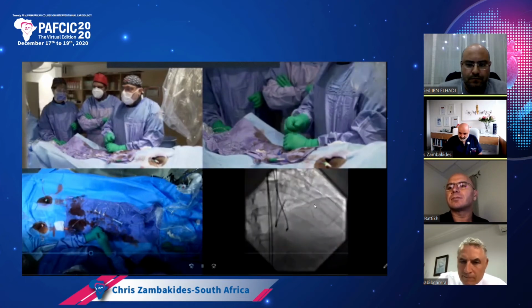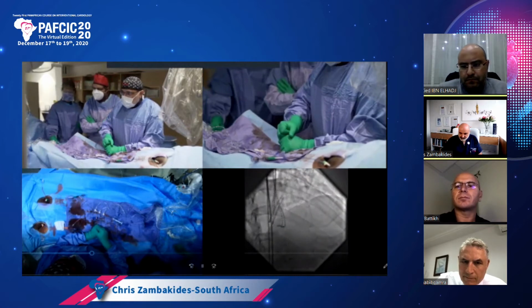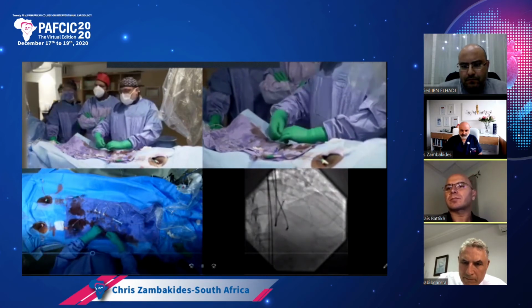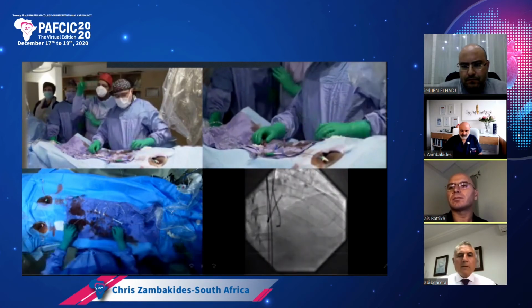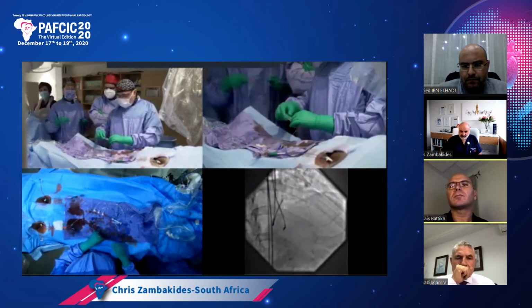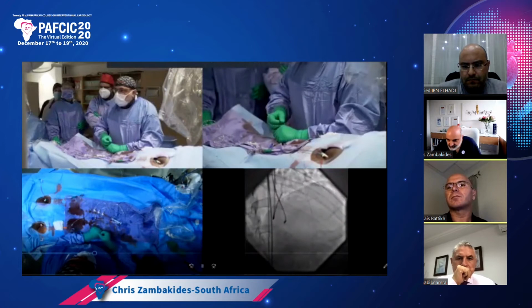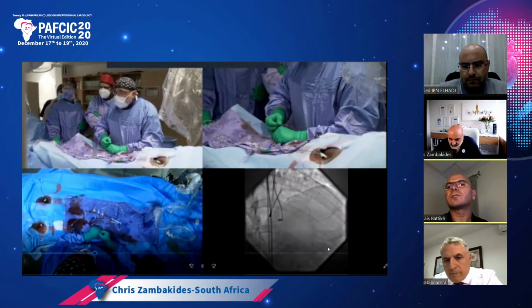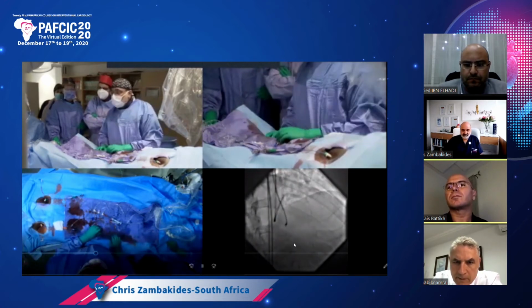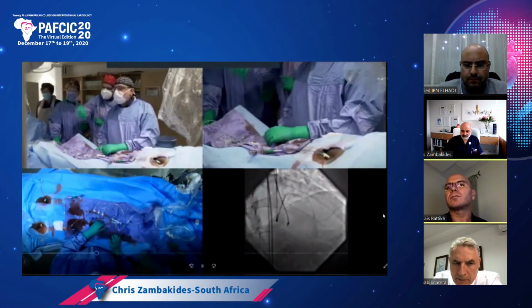Okay. I don't see it filling. Give me a flush. Yeah, there it is. It fills. So sometimes the contrast is very thick and it doesn't show. It's one of those but branches there. So just play it frame by frame.